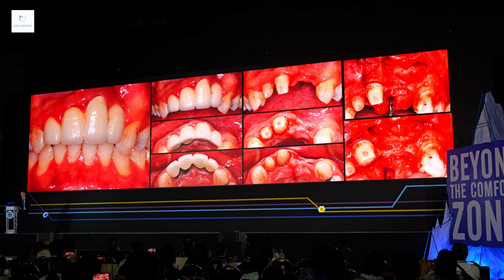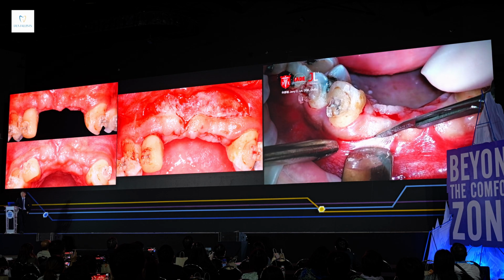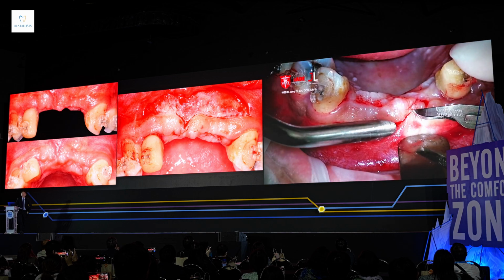Another case for another vertical defect, the patient has shown this kind of defect and discrepancy of the gingival line. So I removed that hopeless tooth and did that procedure, grafted. And the central got a fracture afterwards, then I extracted the central and placed an implant immediately and grafted again. So this is how I correct the soft tissue nowadays.